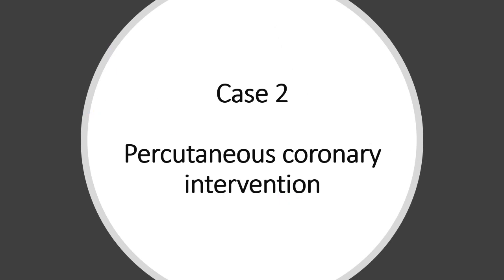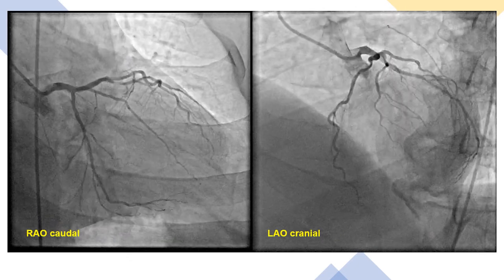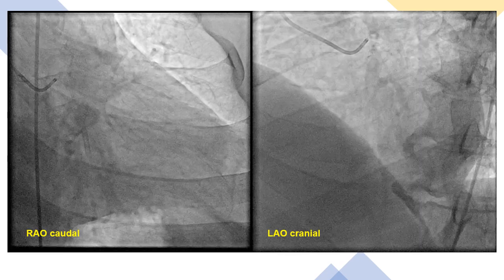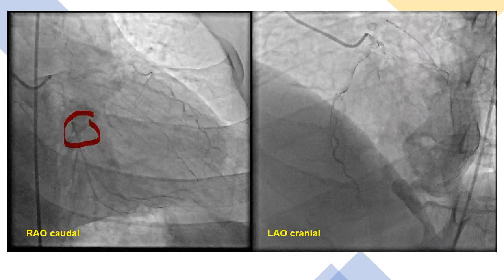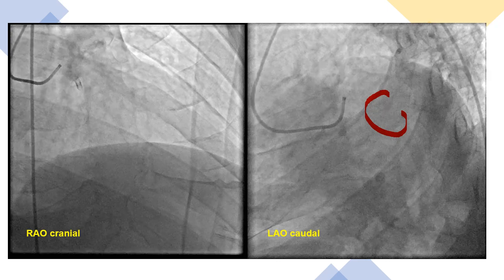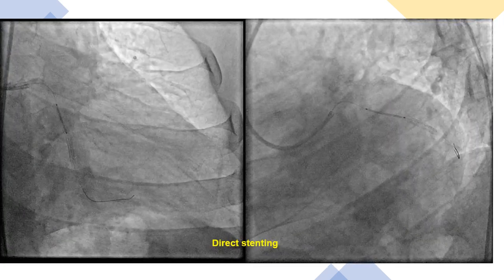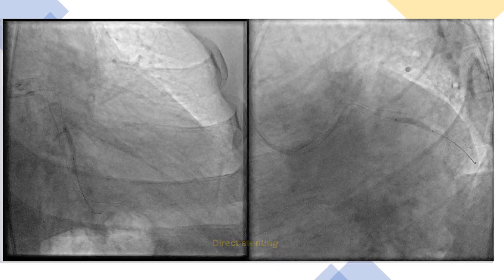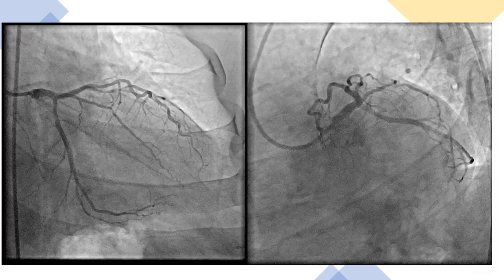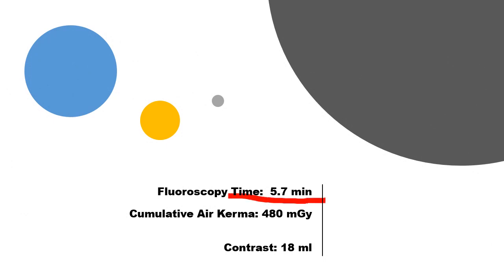Case number two is a case of percutaneous coronary intervention. Our initial simultaneous views on RAO caudal and LAO cranial show a circumflex lesion proximal to a prior stent. This lesion is also seen in the LAO caudal view. We decided on direct stenting, deployed the stent, and had good final angiographic results. Fluoroscopy time in this case was only 5.7 minutes, and we used 18 cc's of contrast for the whole case.